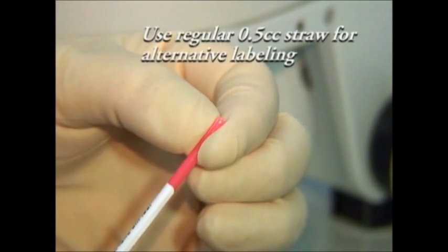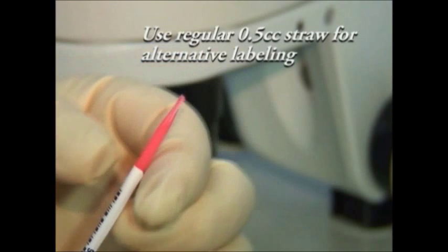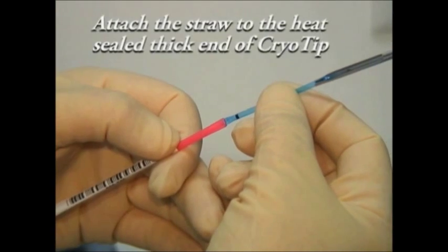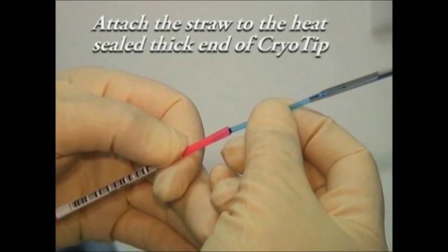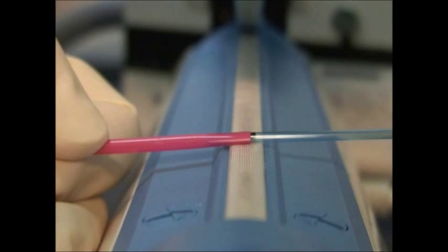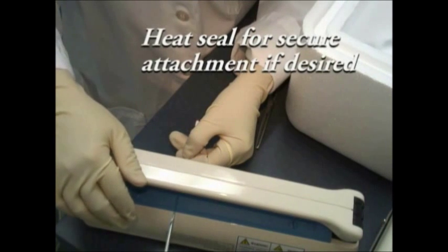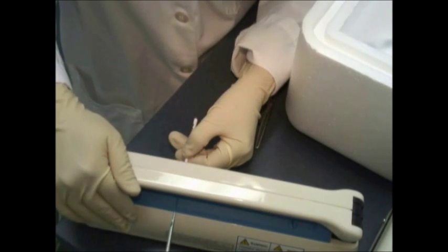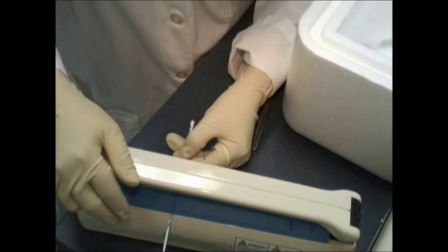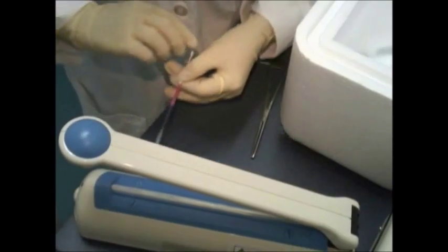Once the seals of the cryotip are checked and are found to be good, the cryotip is loaded onto a straw. Then they are appropriately labeled, heat sealed again, and then plunged into liquid nitrogen. At our lab, we get 85 to 95% survival of embryos after vitrification procedure.